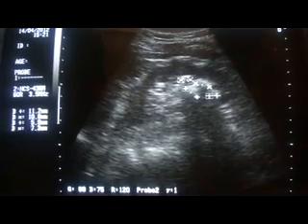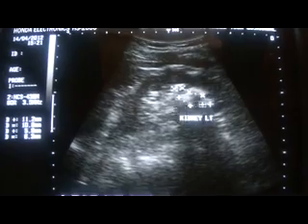Now this is in the longitudinal section, showing how the calculi appear without hydronephrosis. Here we are now seeing in the transverse section. So these are the calculi in the transverse section. In the transverse section, we could get a view of this calculus only — this is the kidney region — and we can see only this area giving posterior shadowing.